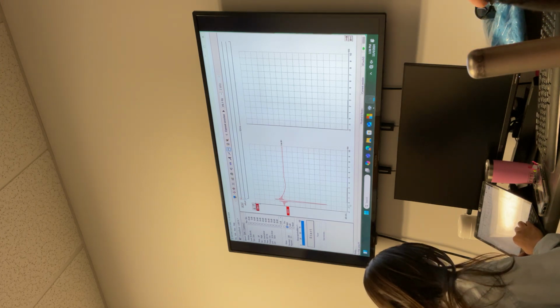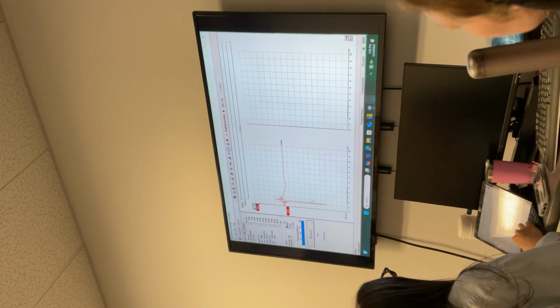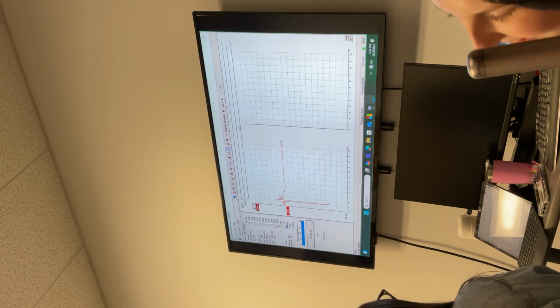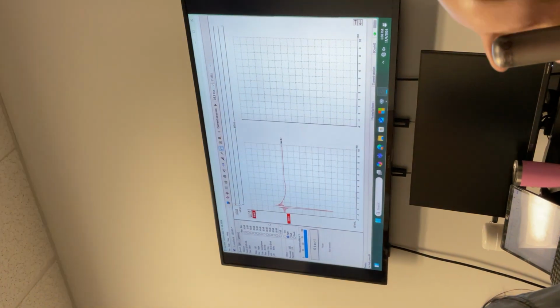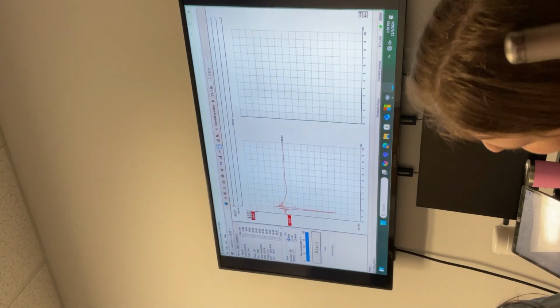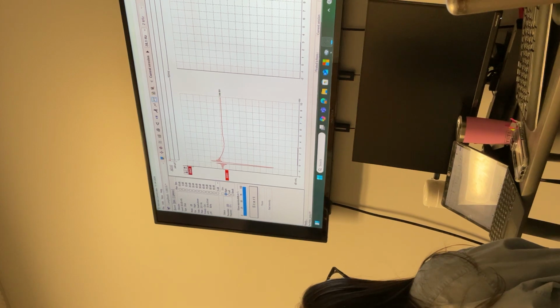So you can see that the stimulus is starting at minus 0.9 millisecond here. That is because of the transducer tube, a time delay of 0.9. You're doing this just to see what stimulus you're playing. Okay, so this is click.